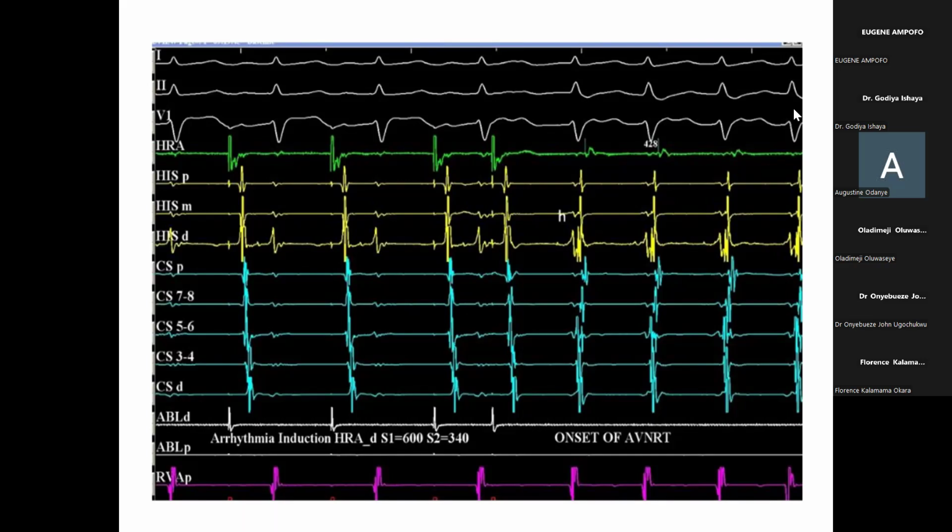Looking only at the surface image might be difficult sometimes to see, but that's why you have a marker in the chambers, to help you know from the beginning the location of where the P wave will be. You get what I mean? Okay, so in such an instance, the HRA is best to locate the P wave.